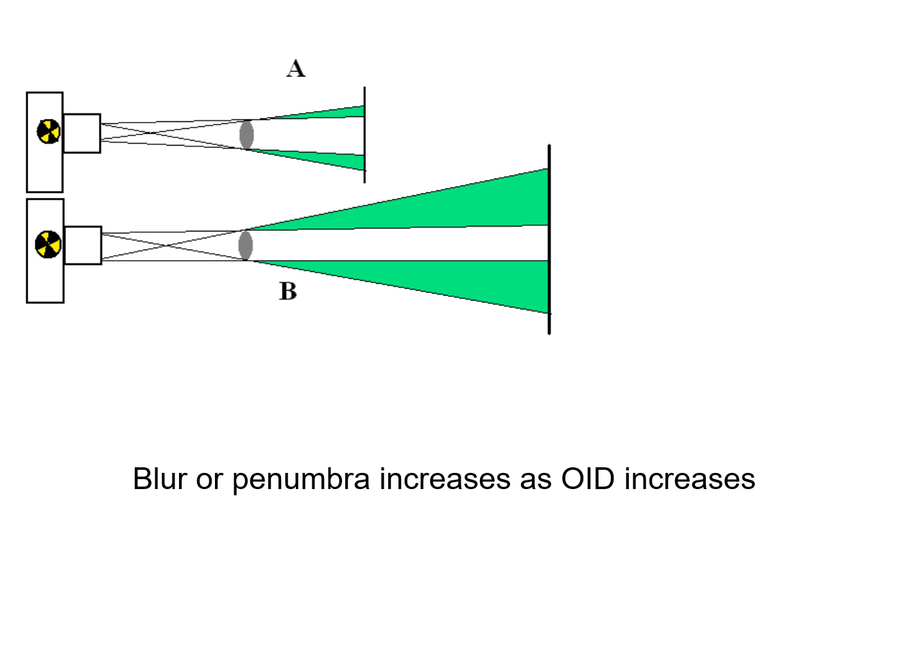And so that's why it's important that, number one, you know how to shoot ribs. You always shoot affected side down, or affected side closest to the image receptor, in order to be able to even visualize a hairline fracture. And then the other thing, in the processing, you do not alter the processing to chest X-ray processing or any other algorithm. You process it as a rib to make sure that there is no smoothing algorithm applied. Those two things greatly affect whether or not your image is diagnostic, or in fact you're not using the technology correctly and you're actually purposely blurring out a hairline fracture. And Mr. Shepard will talk about that in his REIE class as well.